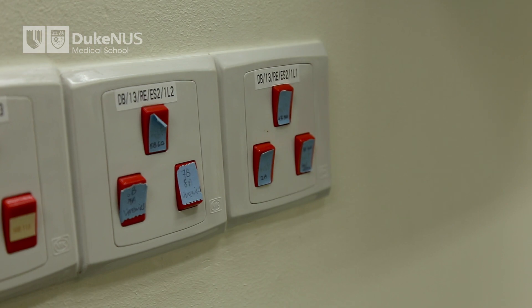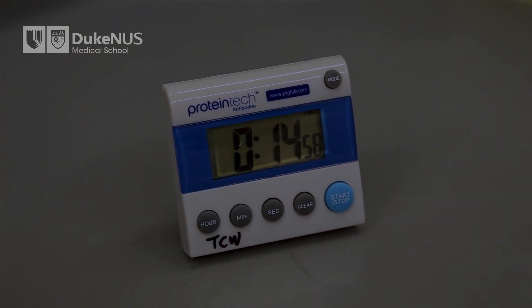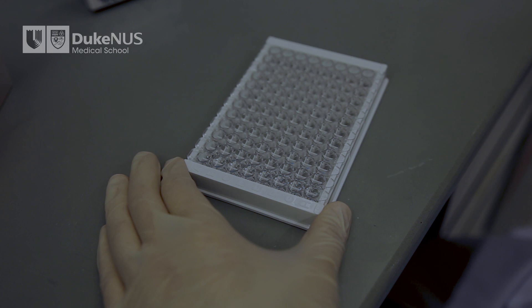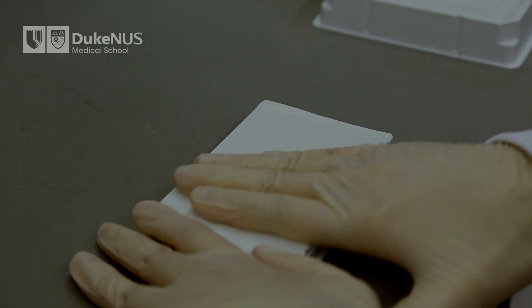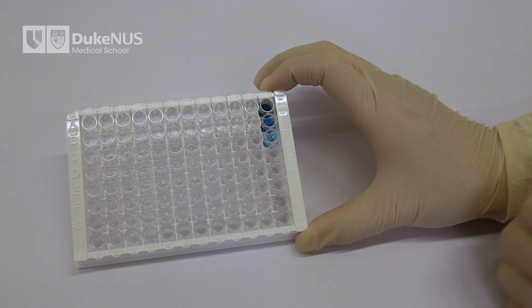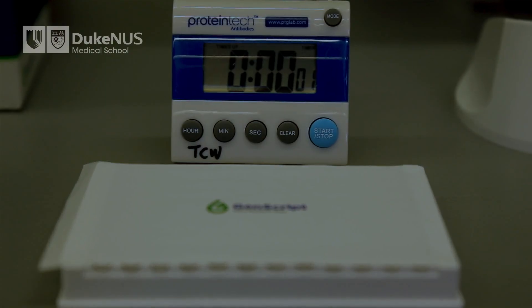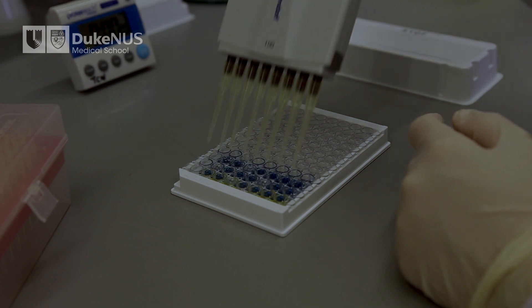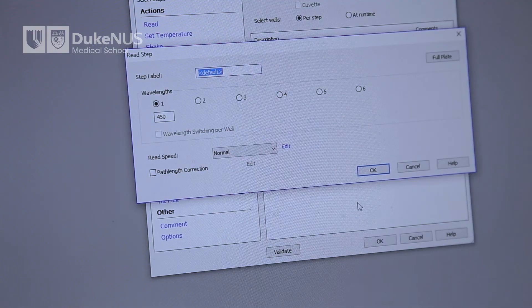It is best to do the next steps in a darkened room as light may interfere with the results. Add 100 microliters of the TMB solution to each well. Incubate the reaction for 15 minutes in the dark at room temperature, which is around 20 to 25 degrees Celsius. The timing is critical — start the timer once you have added the TMB to the first column of wells. If you exceed 15 minutes, you may end up saturating the reaction. After 15 minutes, stop the reaction by adding 50 microliters of the stop solution. You will see a change in color from blue to yellow. Read the absorbance in a microplate reader at 450 nanometers immediately.